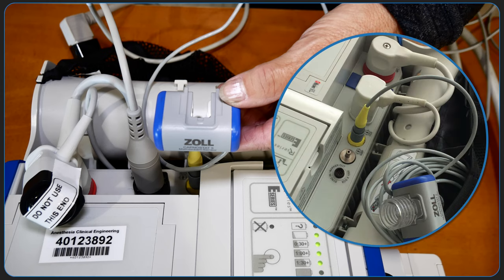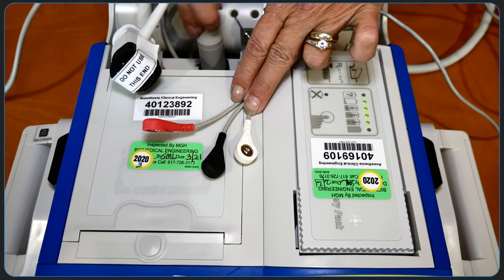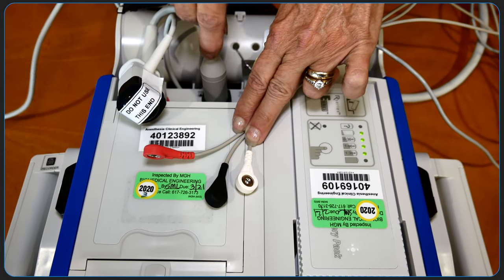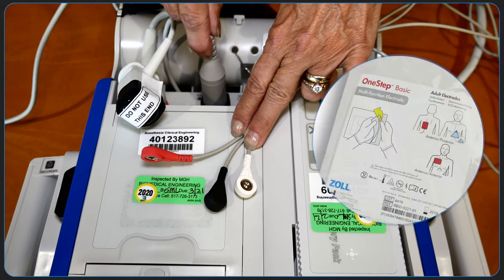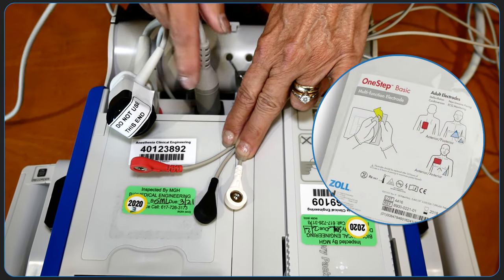Pictured here is the view of the yellow connection site for the Capnostat cable on the rear panel. Also pictured is the Capnostat carbon dioxide sensor with airway adapter. This is the 3-lead ECG cable that connects to the black port on the rear panel. The 3-lead ECG is only necessary for transcutaneous pacing with the multifunction electrode pad; it is not necessary for cardioversion.